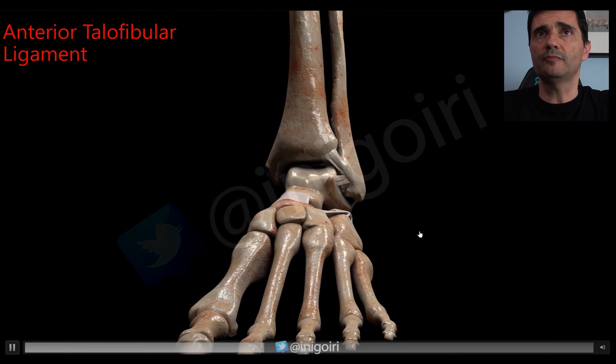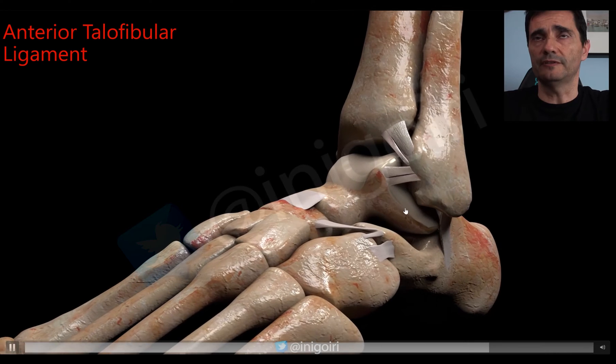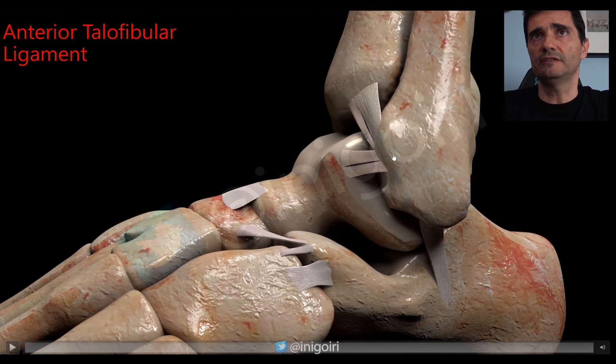The most important by far is the anterior talofibular ligament. This ligament starts on the anterior side of the fibula, and its direction is horizontal — the same direction as the sole of the foot. We must place the probe in this direction to have a good view. Don't forget there are usually two bands: the superior one and the inferior one.